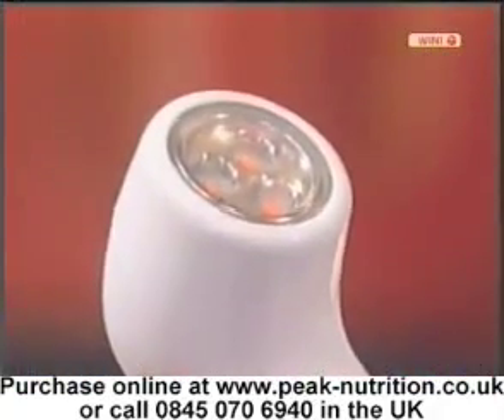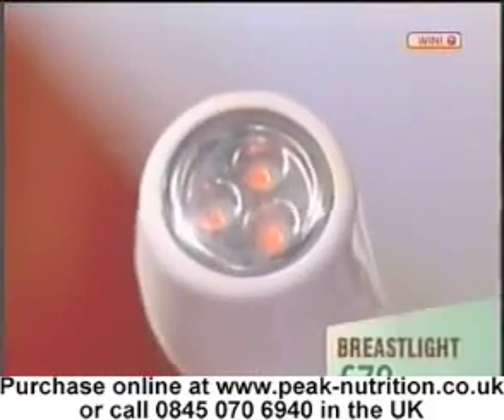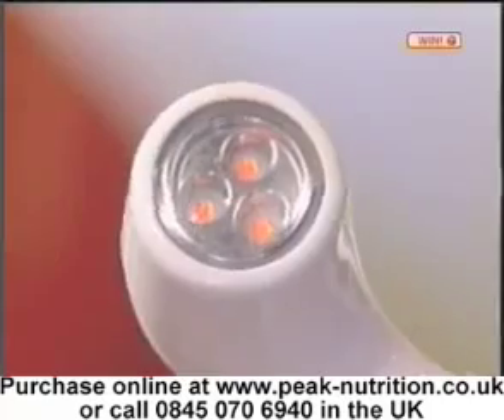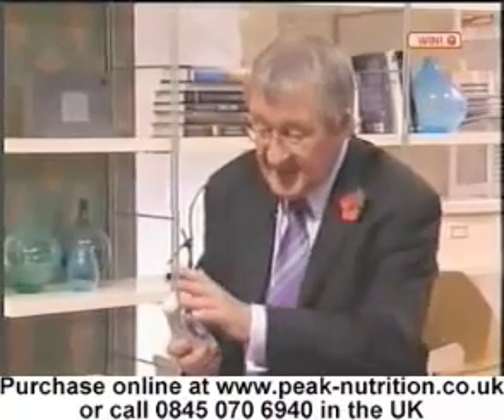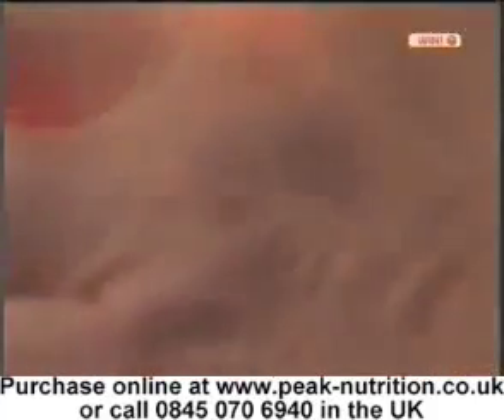As you can see, it's a handheld device. I've switched this on and there are some red bulbs at the tip of it. It actually sends out a high-intensity light, which is obviously a specific wavelength. It switches itself on when it's in touch with the skin.